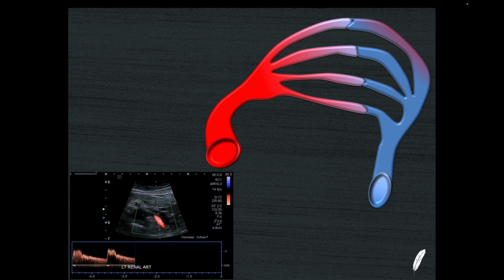But then if you look at the diastolic component of this waveform, it is completely different to the one I've just shown you. In this case, during diastole, the capillary bed is really not pushing back very firmly at all. It's allowing blood to flow through it, and you've got this persistent antegrade flow right through to the end of diastole. If you look at the schematic I've made here, this is the artery coming in, and instead of that myriad of tiny little capillaries, what we've got here is quite an open circulation where the arteries turn into veins and everything's of a decent caliber, so the blood can flow through this circulation and then out through the venous outflow side here with a minimum of resistance.